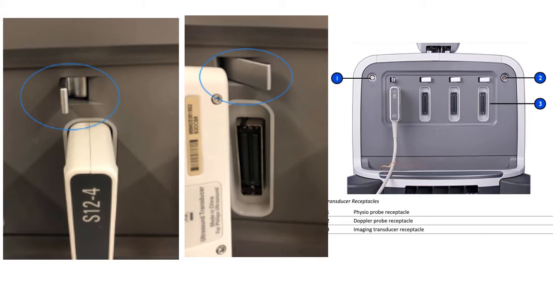Here is the bottom part of the machine — you can see the locked transducer S12-4. Be very careful whenever you lock or unlock the transducer: it's not to be pushed but gently applied, as these transducers are very fragile and require no force to connect. Once connected, it will appear on the touchscreen and you'll be able to select which transducer you want.